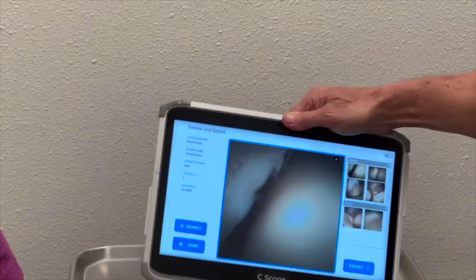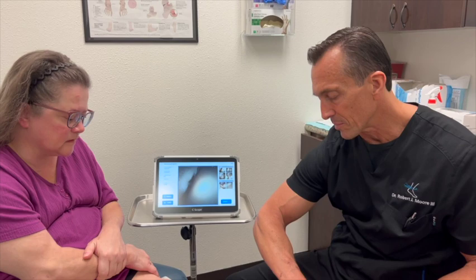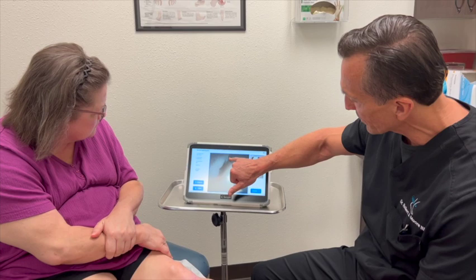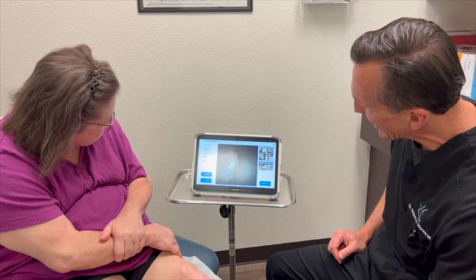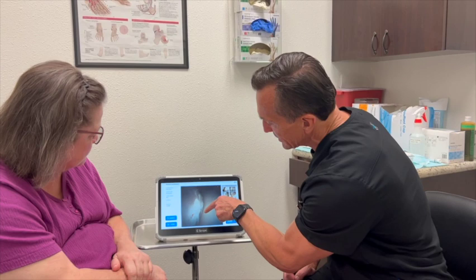So this is the bone — if I had to put this up right, that's your leg sitting up straight and that's the bone underneath. What we have is the part underneath that goes up and down, and this is the part that comes up the shin. This is where you have that little — remember I told you — like a little piece of cuticle kind of peeling up a bit, not terrible. So your foot goes up and down like that, and I think you kind of crushed it up this way into the cartilage. That's the inside of your ankle joint.